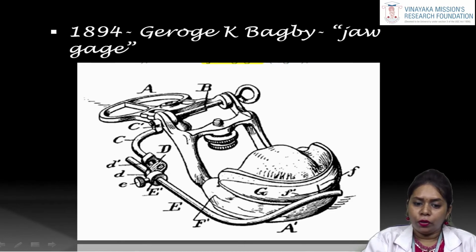Bagby of Newburn obtained a patent for improvement of an articulator of usual construction. He described it as an attachment to determine the location of impression models in the articulator and one that gives an exact measurement desired of the lower jaw when the central incisors are present.